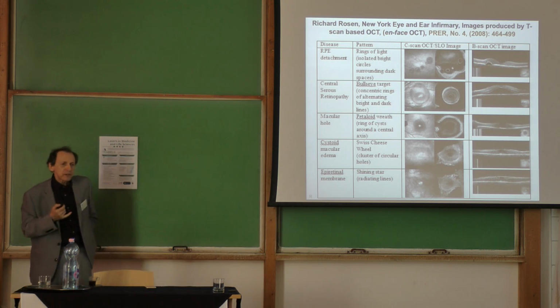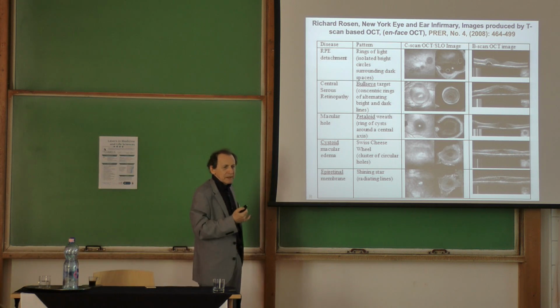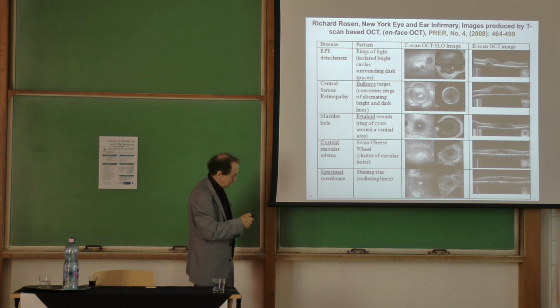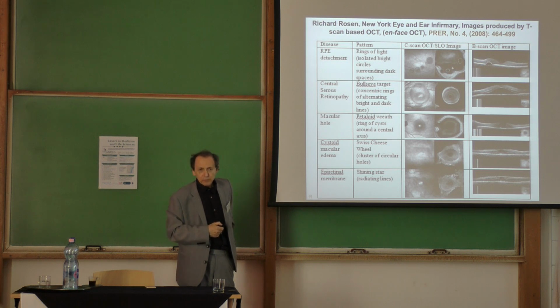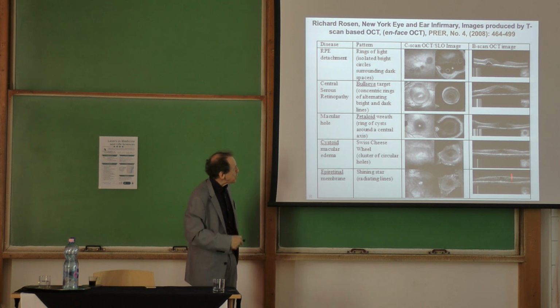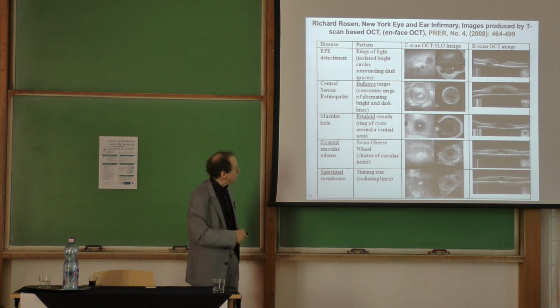There is a lot of work in deep learning, in machine learning, in identifying disease being made by machines. The machines will combine soon this view with this view and do the diagnosis, diagnose without needing us, without needing ophthalmologists. Press a button and they will tell you, you have this. So associations of patterns in B-scan, C-scan would help them.